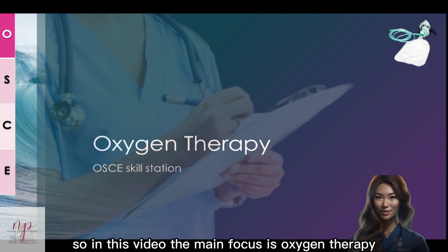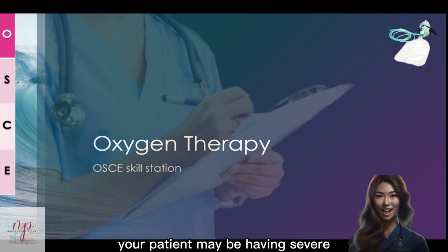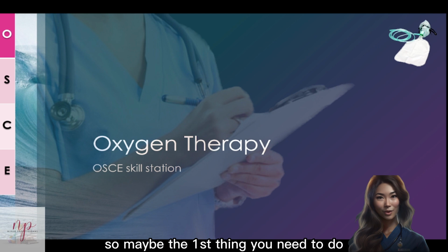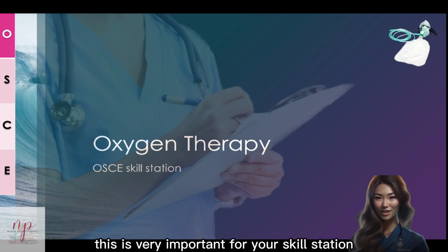So in this video, the main focus is oxygen therapy. You need to be ready that your patients may be having severe shortness of breath. So maybe the first thing you need to do is pop up your patient. This is very important for your skill station.